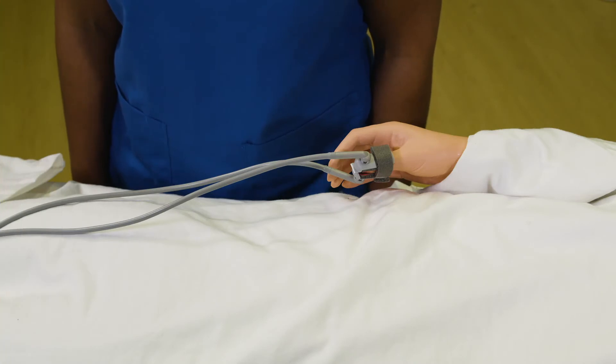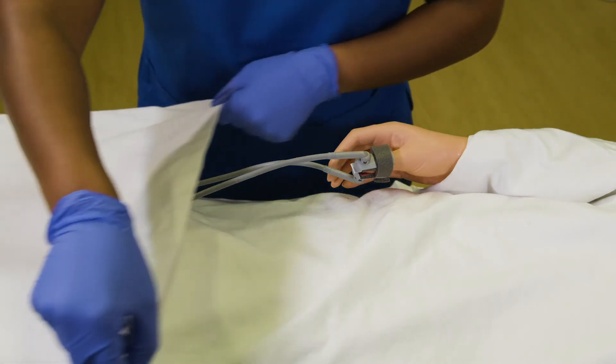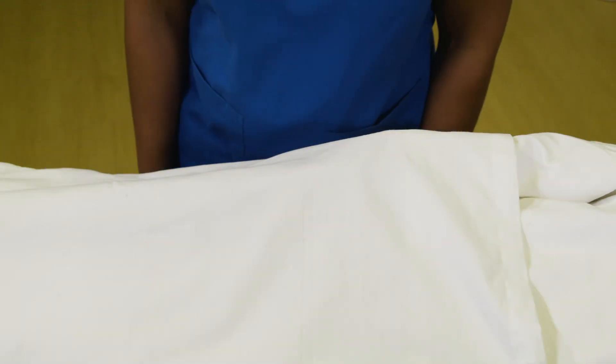After you place the clip on the patient, cover the SPO2 clip with an opaque blanket to keep ambient light from affecting the reading. Ambient light, attachment movement, or electromagnetic interference can lead to inaccuracies of the SPO2 reading.